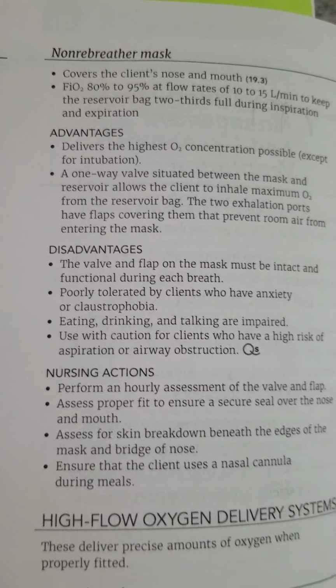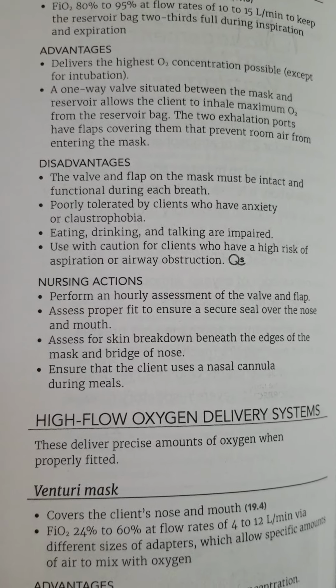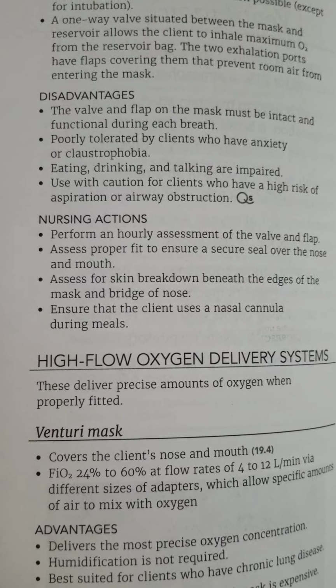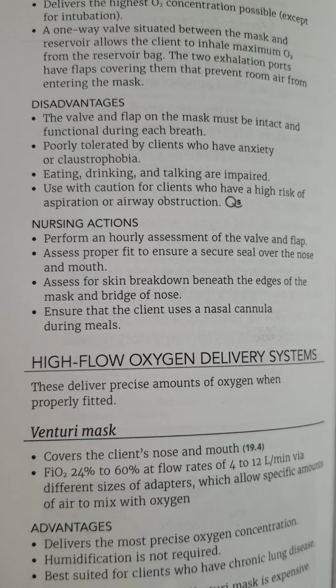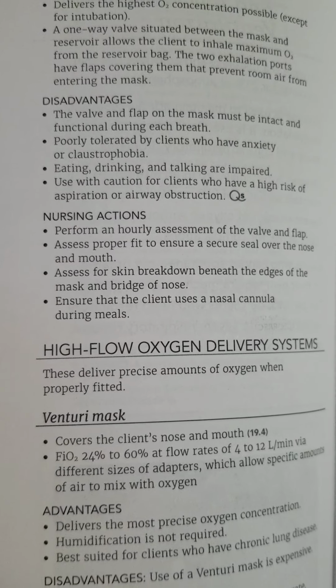Non-rebreather mask disadvantages are that the valve and the flap on the mask must be intact and functional during each breath. Poorly tolerated by clients who have anxiety or claustrophobia. Eating, drinking, and talking are impaired. Use with caution for clients who have a high risk of aspiration or airway obstruction.